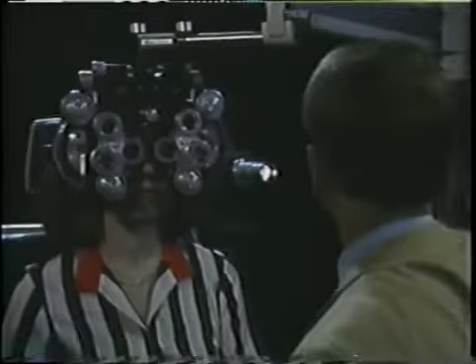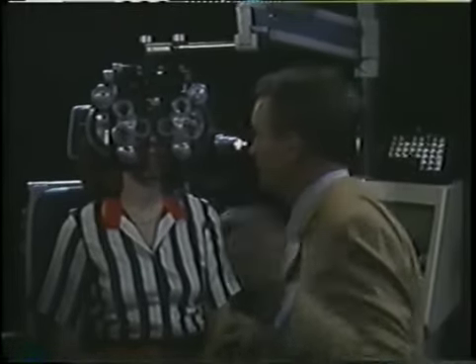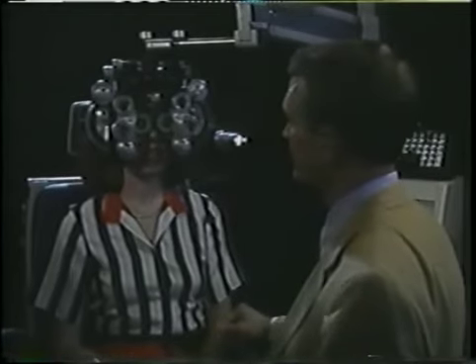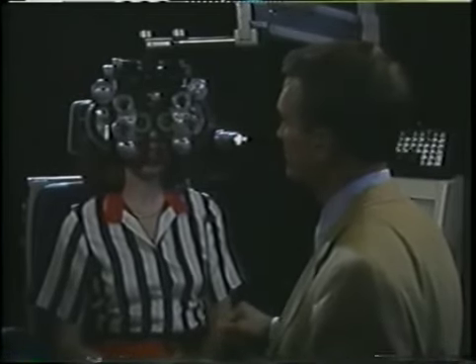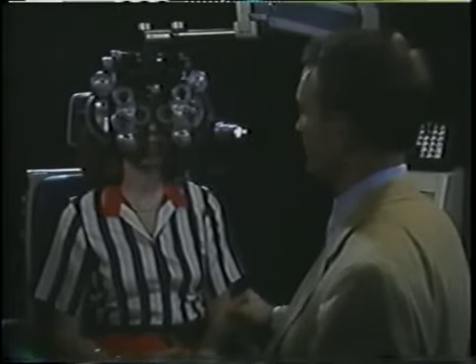This should be followed by subjective refinement of the refraction whenever possible. Tell me, what's the smallest line in the chart you can read? TZVECL. Good. Very good. Now we'll go to the other eye.